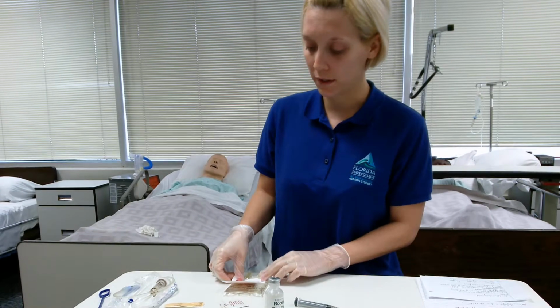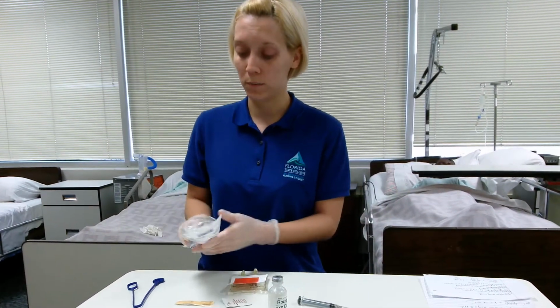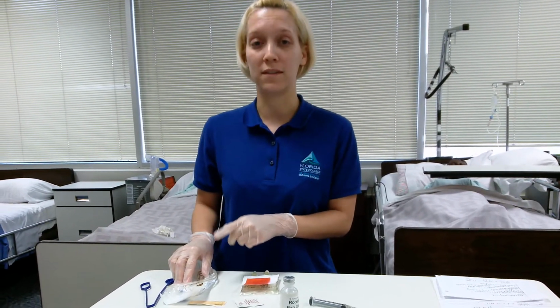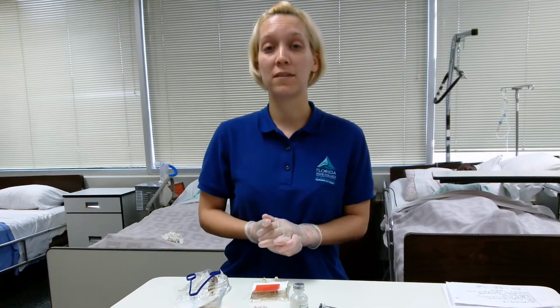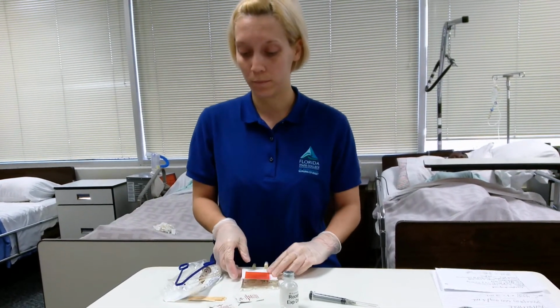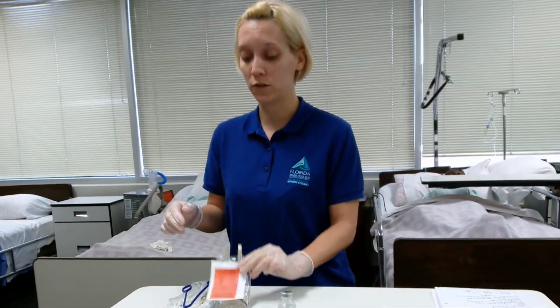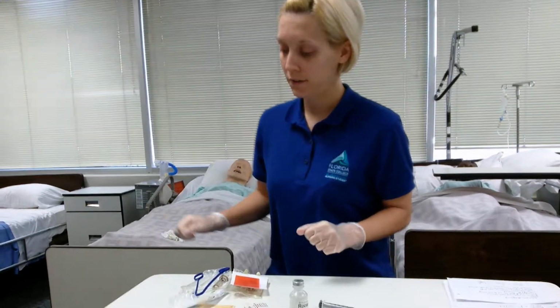So now I'm going to check the integrity of my tubing. I've already done that. I'm going to label my tubing as well with the date, the time, and my initials. So I'm going to gather my supplies and go into the patient room. I'm going to remove my old gloves and wash my hands before I do that.